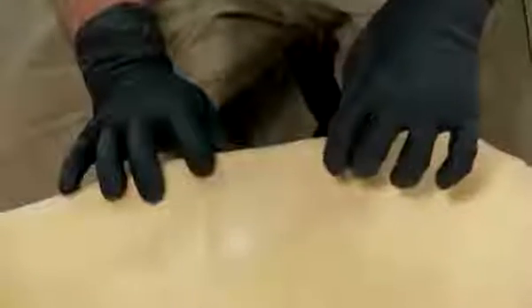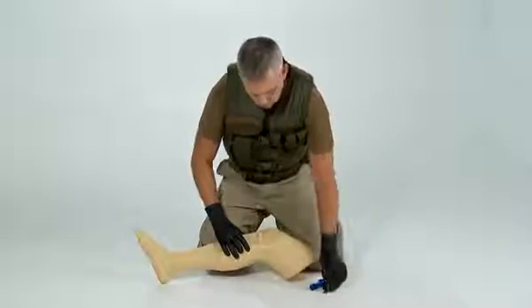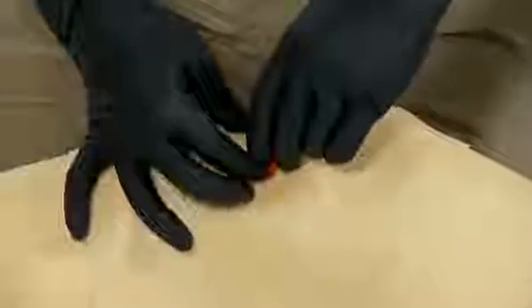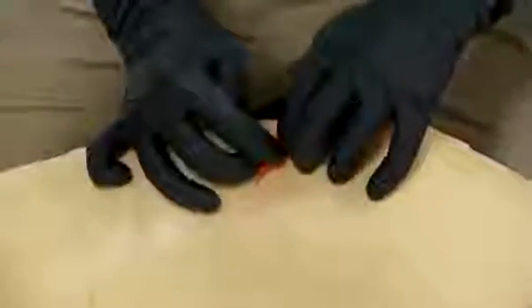Pull out the trocar by pulling upward and twisting. Only the cannula remains in the bone. Always discard sharps, such as the needle and trocar, into the sharps container. Use the red safety latch to provide additional stability by pushing it around the cannula and taping it down.